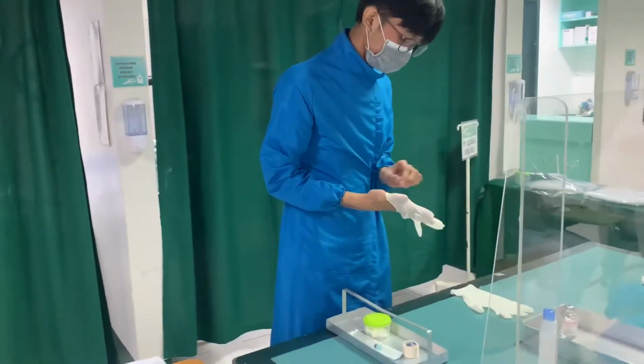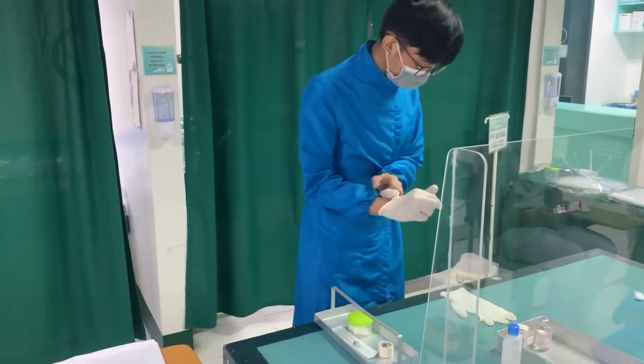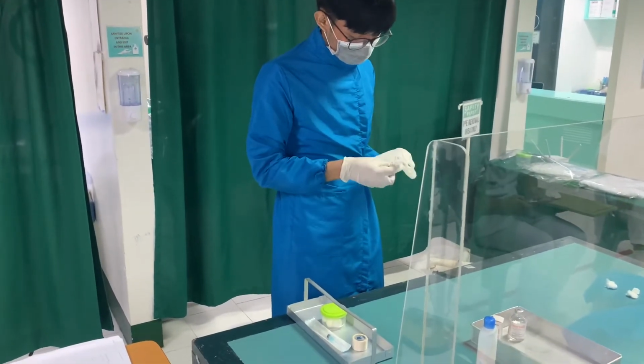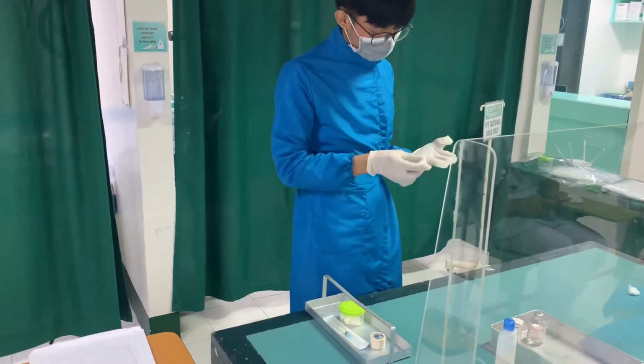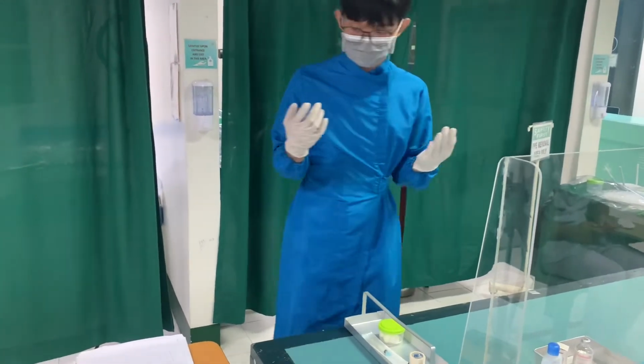Perform hand hygiene. Then move the medication cart to the outside of the patient's room or prepare for administration in the medication area. Unlock the medication cart or drawer, enter passcode, or scan employee identification if required.